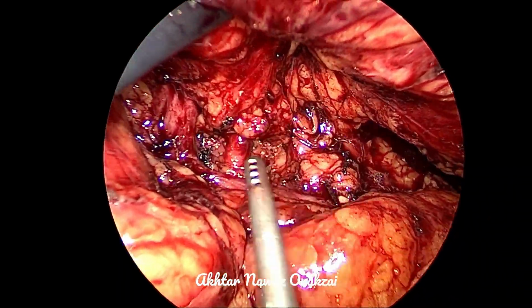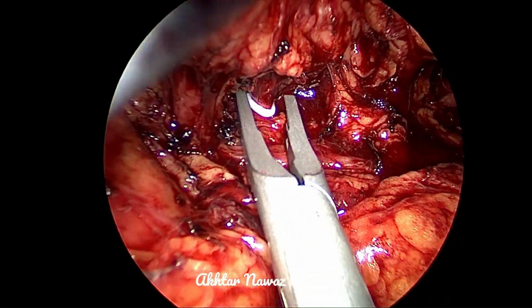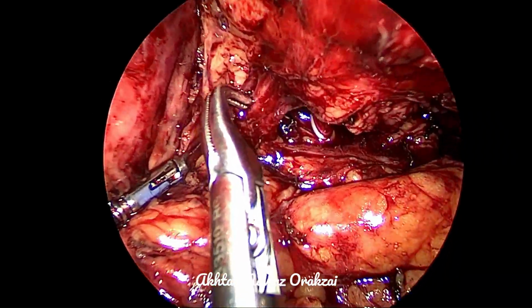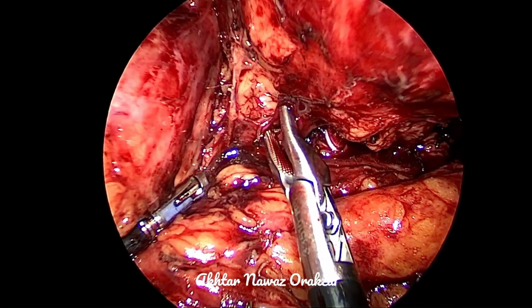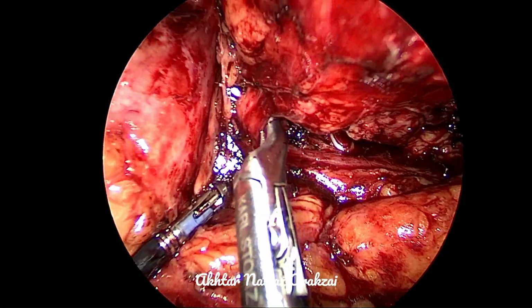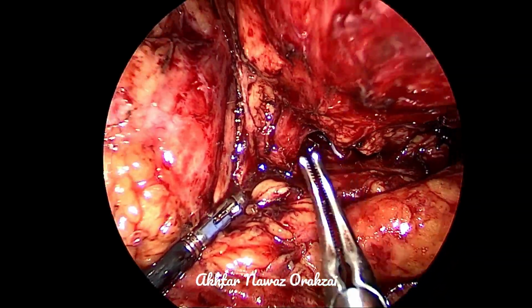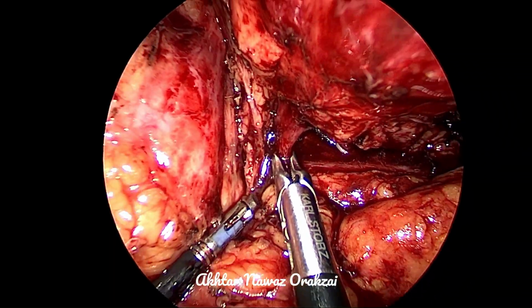Once the artery is clipped, our confidence will be boosted, and we'll feel more relaxed. The anxiety will be decreased. So we'll be able to deal with the hilum in a more confident fashion. So here you can see we have clipped the artery. Now we are dissecting the vein.